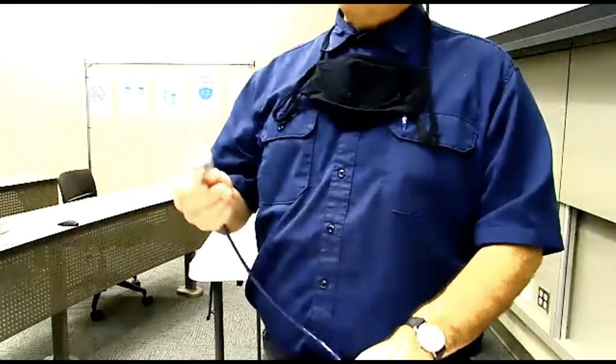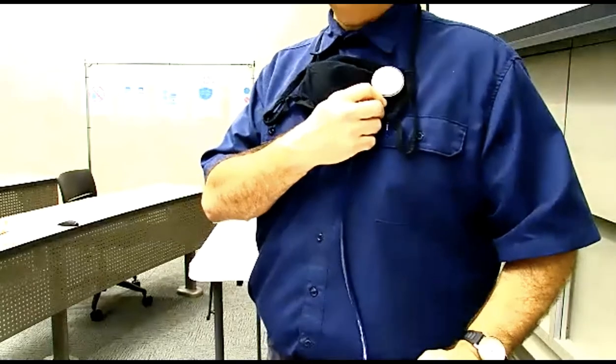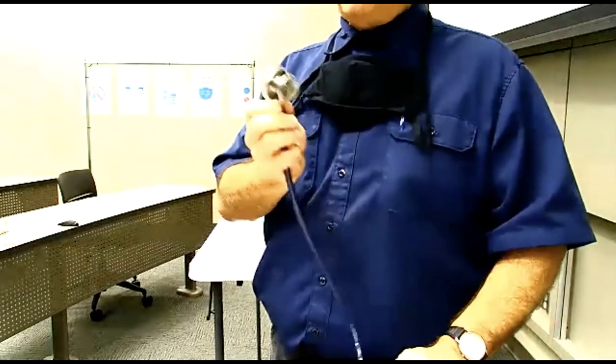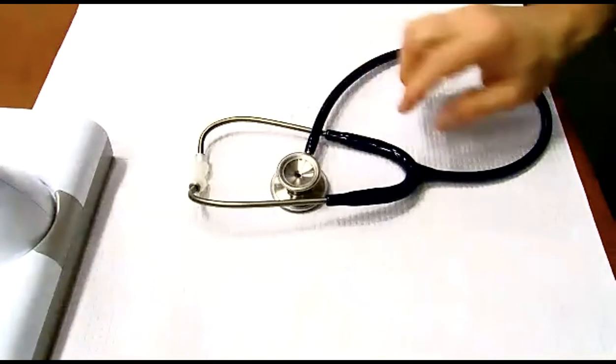Well, what about the cardiologist? The bell is used by cardiologists because they would put that over the chest here and listen for the heartbeat. So when you listen to the lub-dub, the S1, S2, S3 heart sounds, those work much better with the bell, all right? So lung sounds with the diaphragm, heart sounds with the bell.